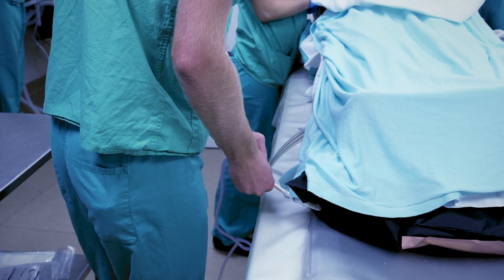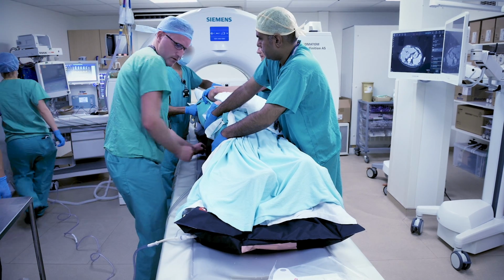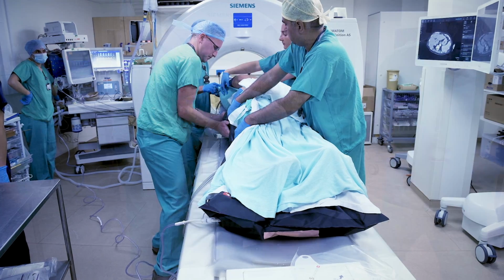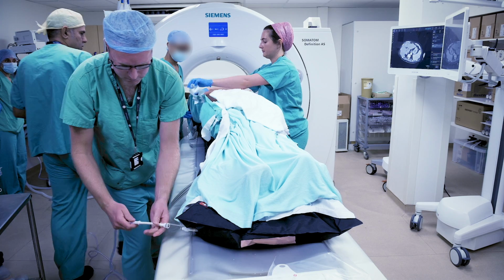Just leave it off for the moment. We're going to just vacuum on. Fine? Yep. Okay, yep. So let's have a look.